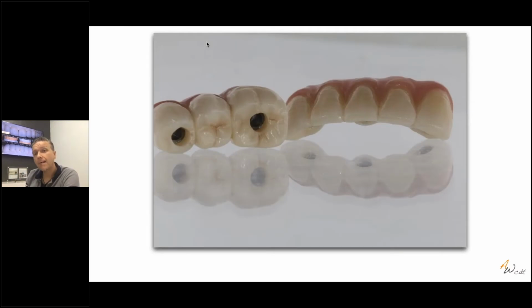And anatomy and texture, again here, for me, very difficult are always lower incisors. They're just very difficult to have them appear very natural. And I think this looks very nice here on this anterior bridge. We see the line angles, definitely. We see little horizontal lines and stuff. So that comes out very nice.